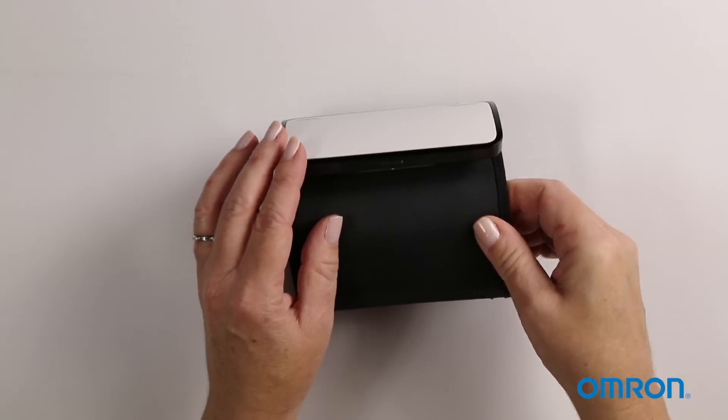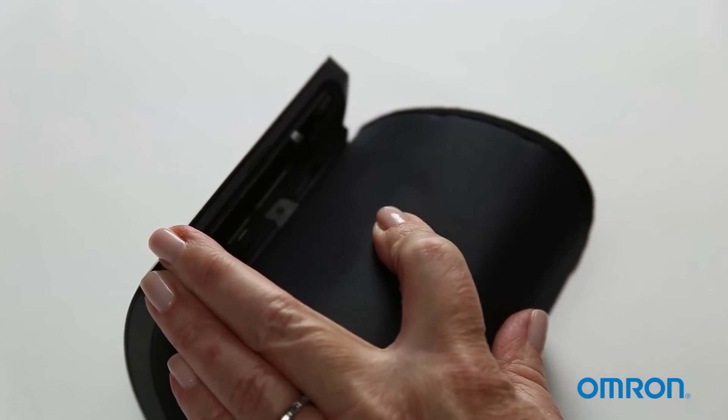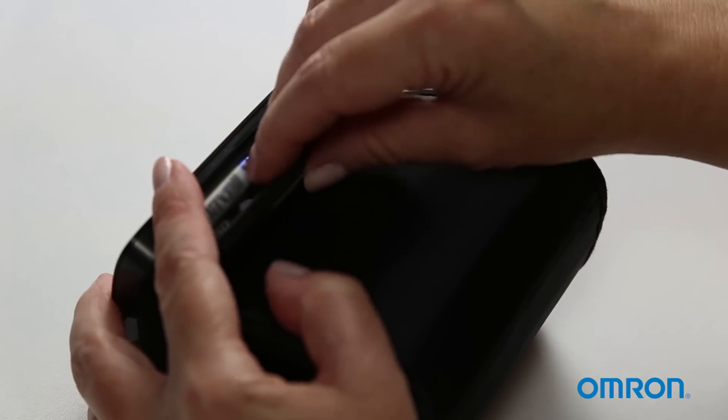To get started, slide your fingernail into the slot on the battery cover and then push it down to open. Insert four AAA batteries, then securely close the cover.